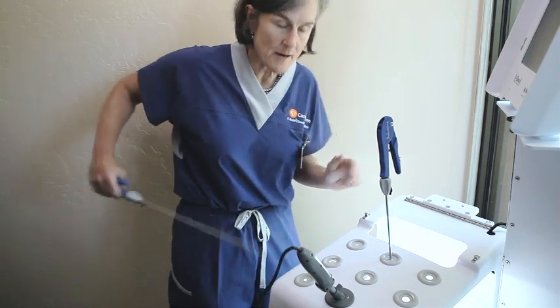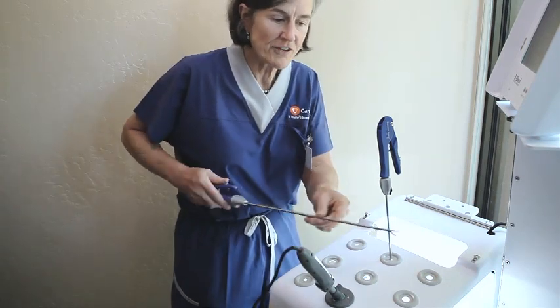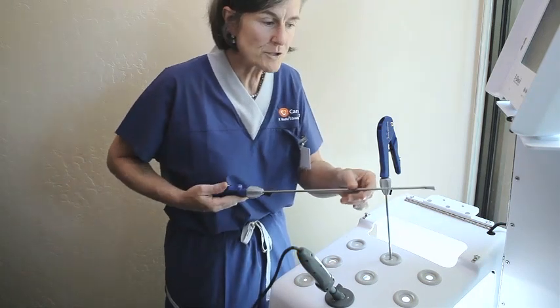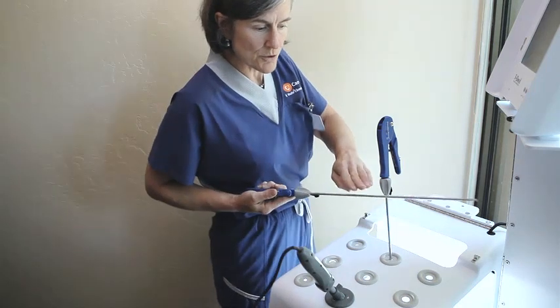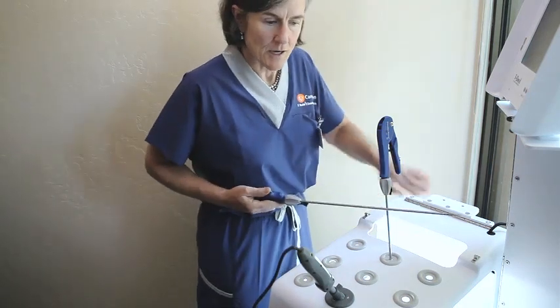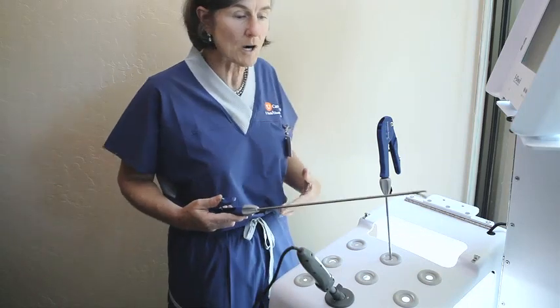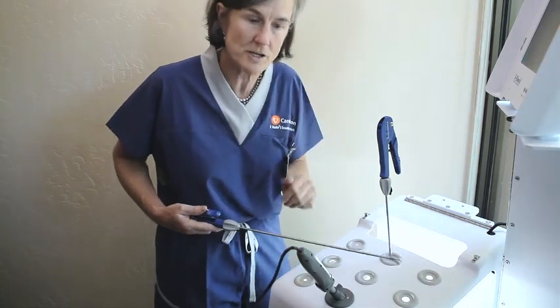Why is that? Because I'm right-handed and the physiologic motion in suturing is to suture towards your own midline, which would mean suturing in towards the vagina on a patient by standing on her left. If you are left-handed you'd want to stand on the patient's right.